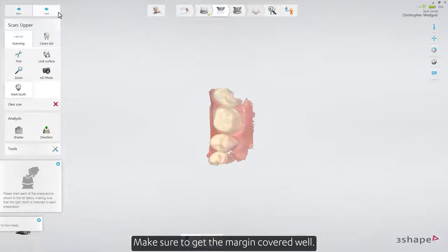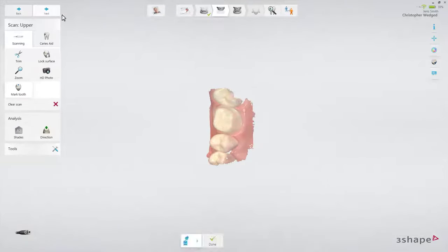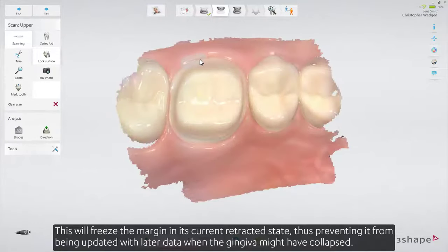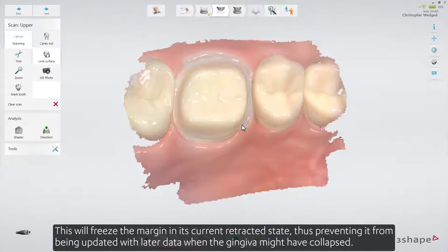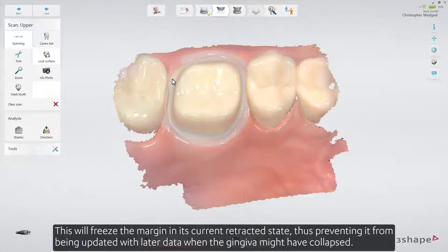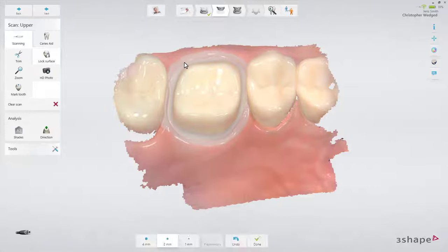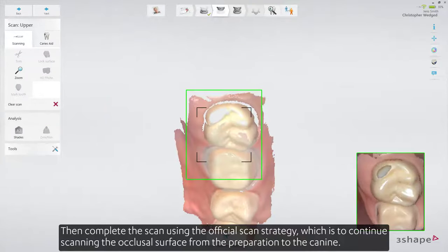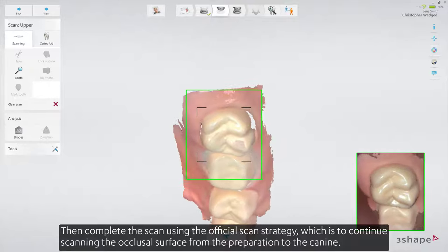Make sure to get the margin covered well. Then paint the margin using the lock tool. This will freeze the margin in its current retracted state, thus preventing it from being updated with later data when the gingiva might have collapsed.